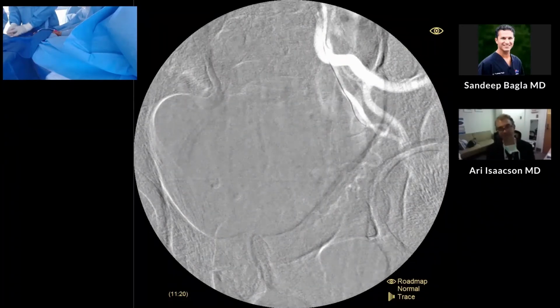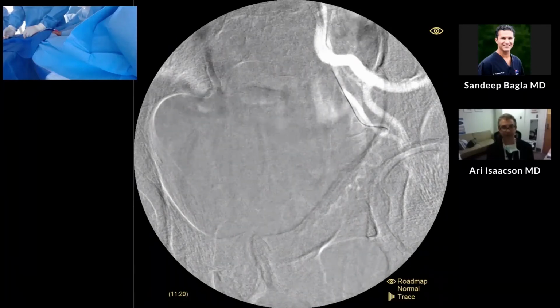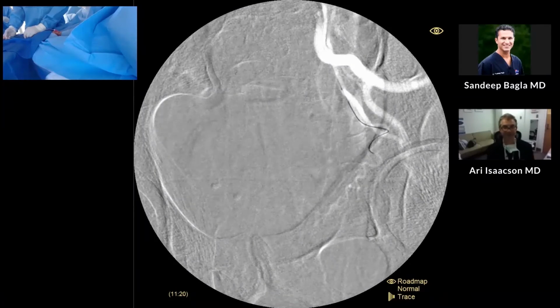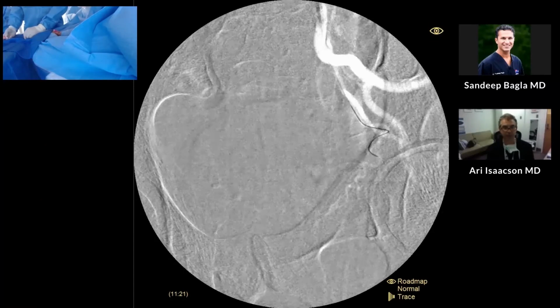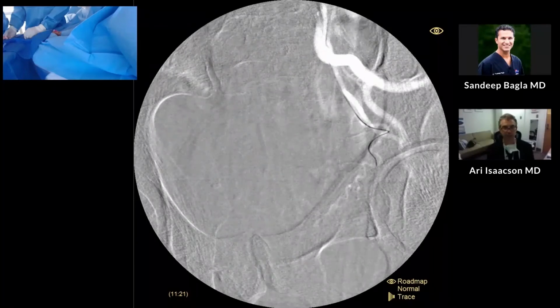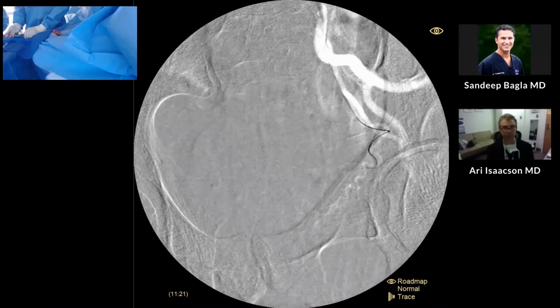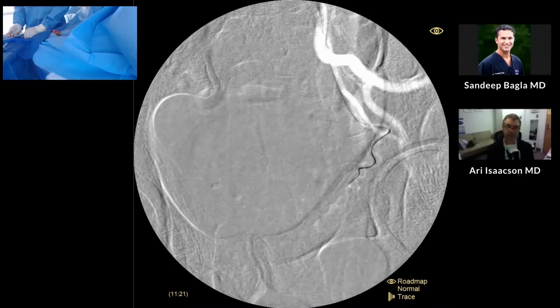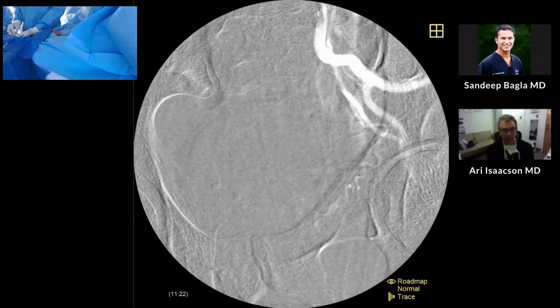Just to show you here, we already have this. I don't want to switch gears on you too quickly, but we got our wire down. You can see the TrustSelect going over our wire into the prostatic artery proper here. Like you mentioned, we'd like to go really as distal as possible, mainly because I want to avoid proximal non-target, seminal vesicle, bladder, et cetera. But if we do need to coil a collateral. So we're putting that TrustSelect in the prostatic artery here, and we'll do a run.